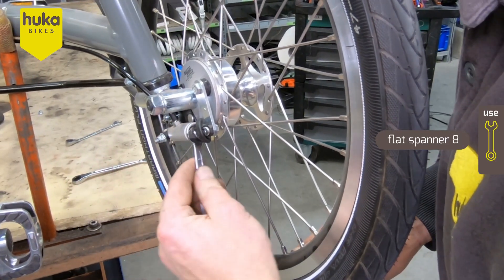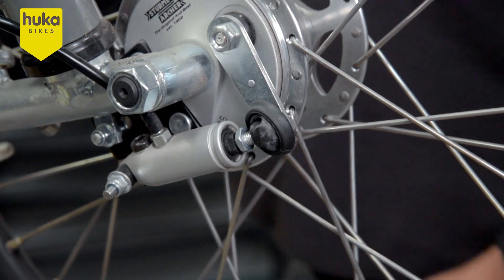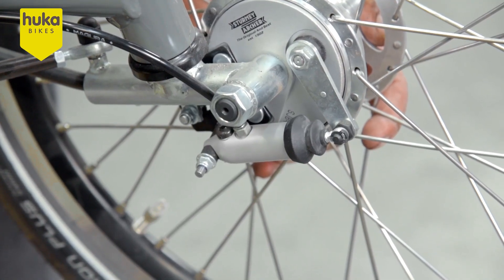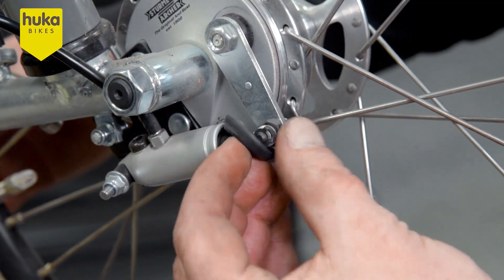Turn the cylinder with a flat spanner 8 to make the arm longer or shorter. Make sure the brakes do not rub. Now tighten the M6 lock nut again and slide the rubber back.